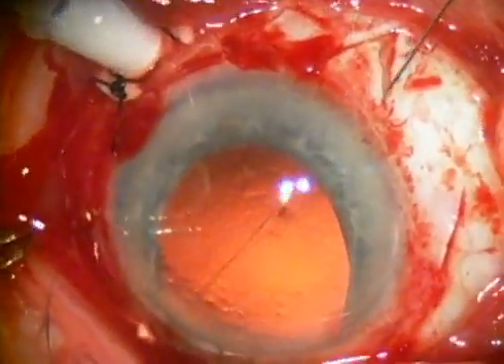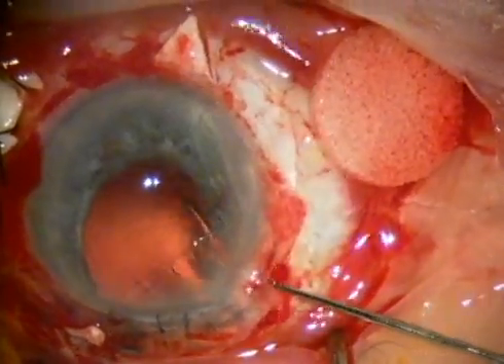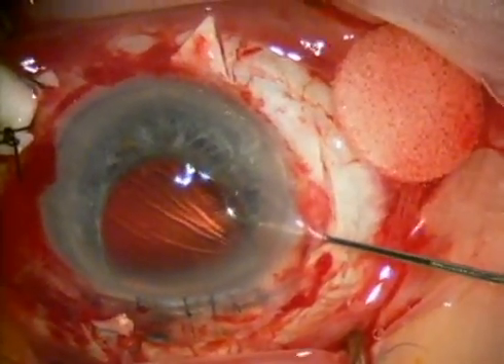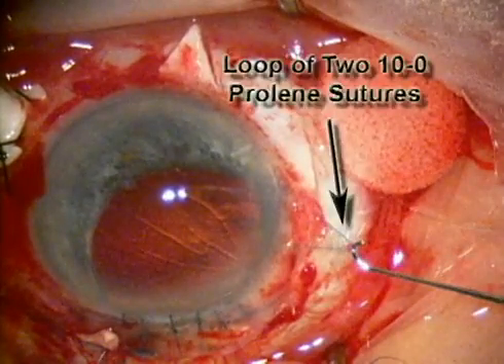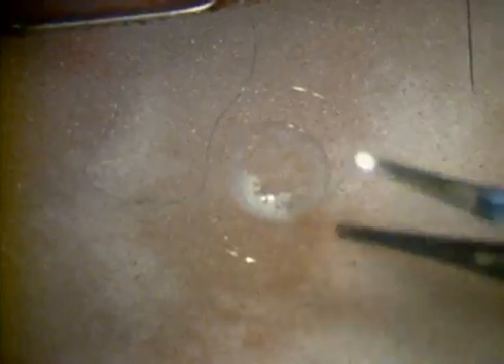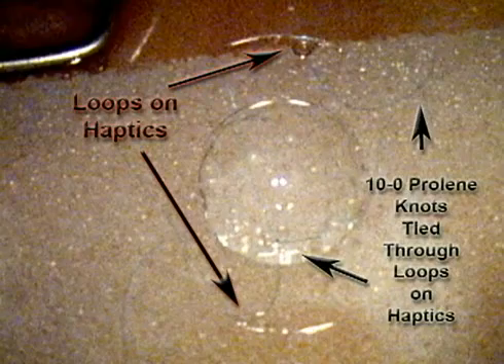It's important these needles be placed just behind the iris. At this point in the surgery, the two suture passes have been made, and now the suture inside the eye is pulled out through the incision where the lens will be inserted later. You'll see that this prolene suture is now tied around the intraocular lens, and that's what will be used to support the lens inside of the eye.